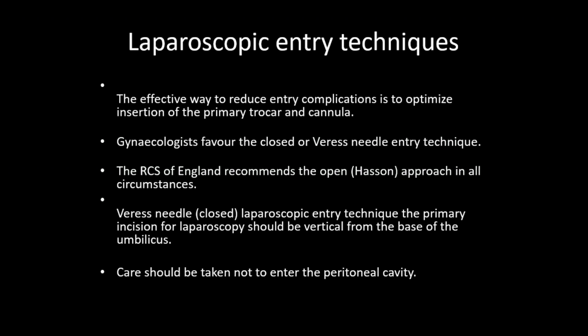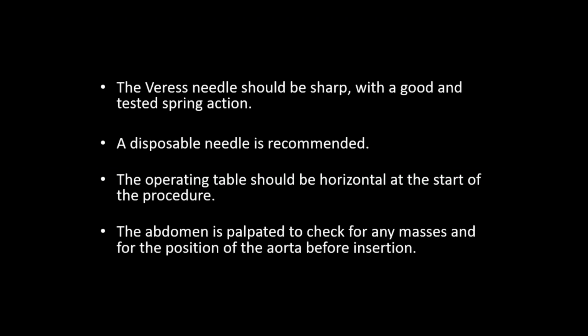Very important point. Another way how you can manage a high-risk patient rather than open technique, sometimes you may enter the peritoneal cavity from another point, like Palmer's point entry, which is located 3 centimeters below the left costal margin in the mid-clavicular line. 3 centimeters below the left costal margin and the mid-clavicular line, away from the possible adhesions inside the pelvis or around or whatever. It will be ideal.